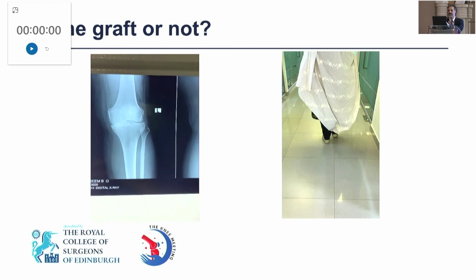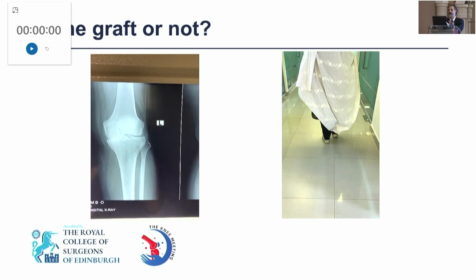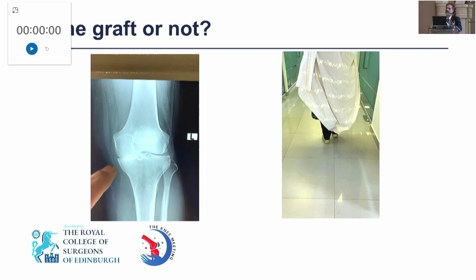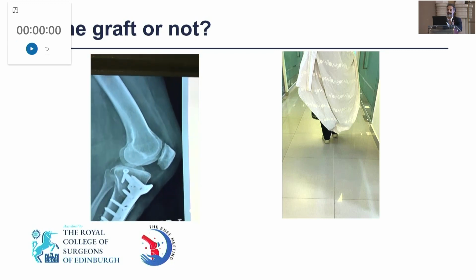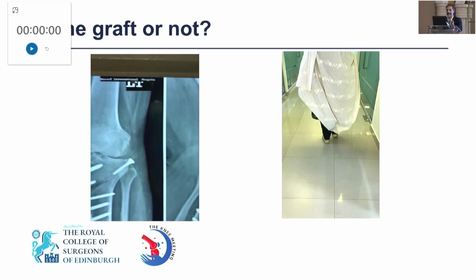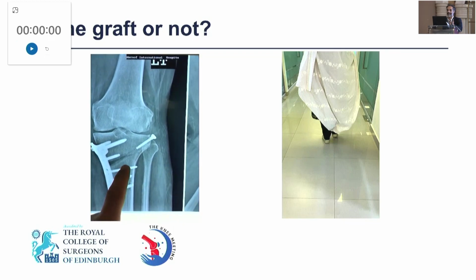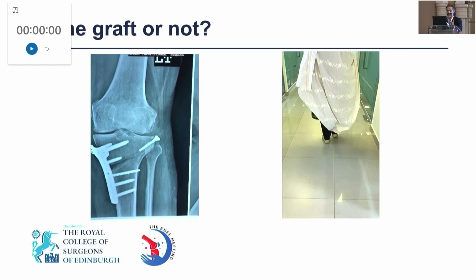So what do I do in this? I end up getting a few of these. So this is a lady who's mid-40s. She's a widow, she's a school teacher, and she's got 3 kids. And I don't think she has enough money for me to offer a joint replacement surgery of whatever description. I don't have the luxury of having specific pre-contoured osteotomy plates. And I've put a blocking screw, and even then the fracture has propagated.